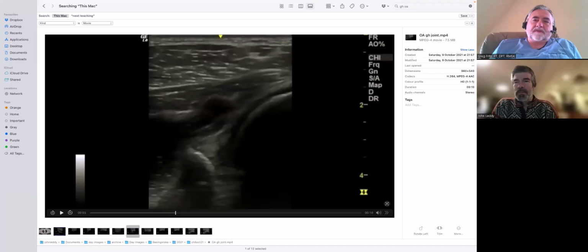But the tendinopathy that my colleagues sometimes call when they scan these patients is partly artifact, because it's often taking a perverse course, and these are more difficult shoulders. But yes, these are not the classic cuff tear. That complete cuff tear and arthritis is quite a late stage, older patient. And yes, you do see those.